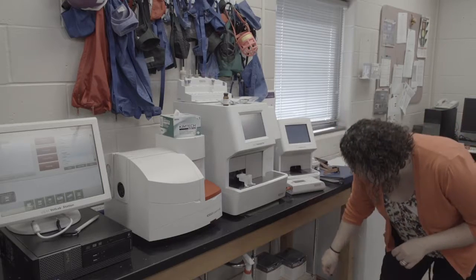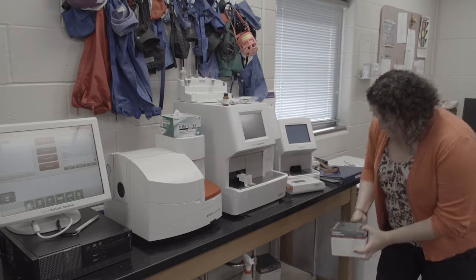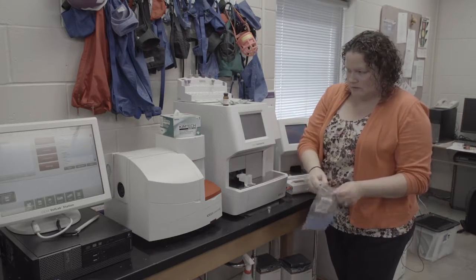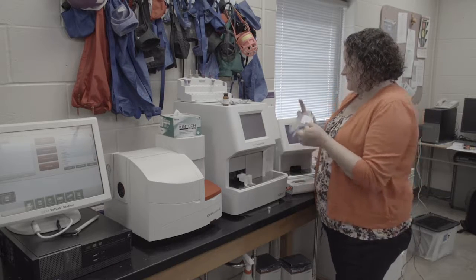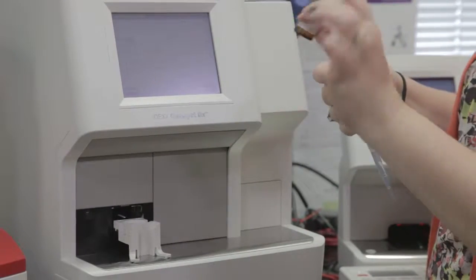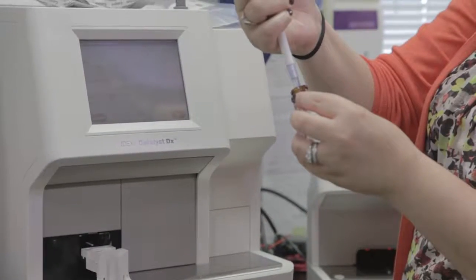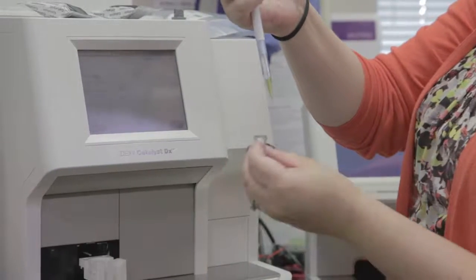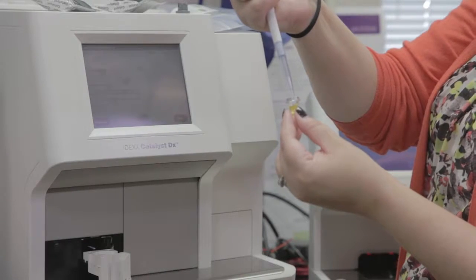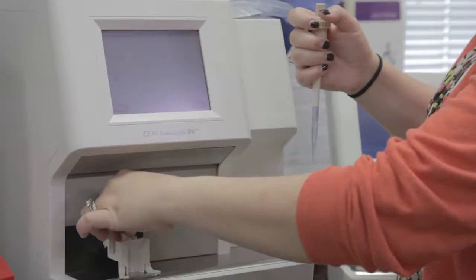So we are going to take one of our sample cups. And I'm going to take my 300 microliter pipetter and one of my tips. I'm going to press my tip on firmly. Make sure that my sample's well mixed. Depress my plunger, 300 microliters, slowly into my cup. You're shooting for no air bubbles with any sample that you put in here. And I got none. Okay. I'm going to set the sample in my sample drawer.